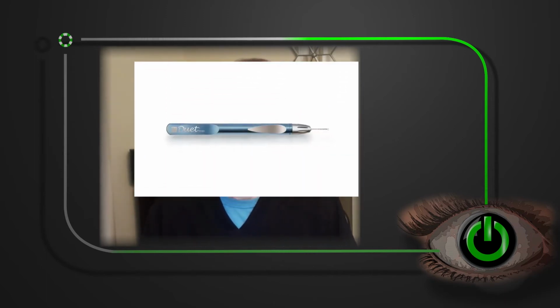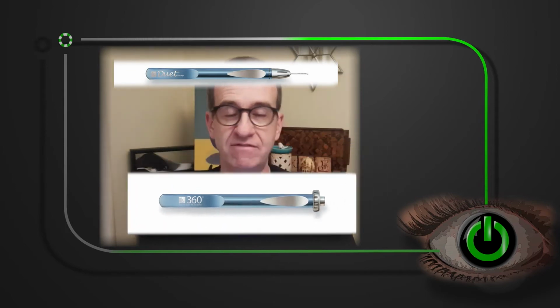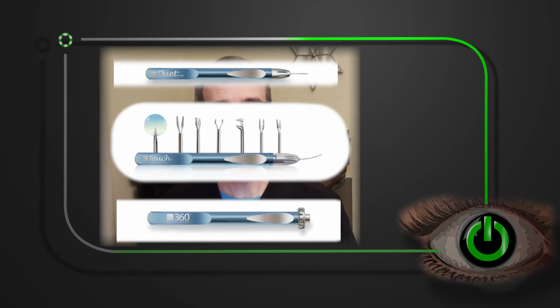Another option would be to use the MST instrumentation. They have a lot of very good anterior segment instruments, though they're much more expensive than the disposable Alcon scissors. If you have retina surgeons that operate in your facility, you may have the older 23 gauge scissors and manipulators, which they used to use before they migrated to the more standard 25 gauge instruments at this stage, and those also can be used without having to purchase anything additional.